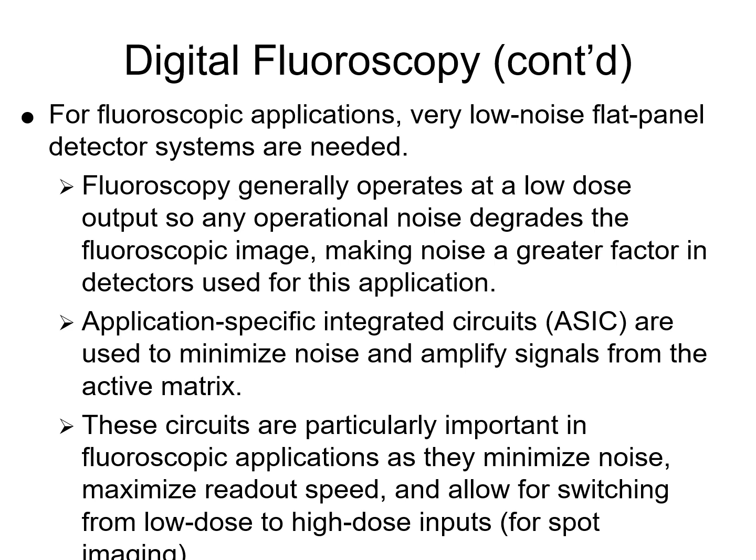Or sometimes they call those eddy currents. What's an eddy current? It's a current that flows in a circle, or it flows against the flow of the intended current. Okay? And so you'll have eddy currents. When eddy currents form, rather than the electrons transitioning down the circuit line in a linear fashion, the electron will just spin and loop back around, like on the wire or on the circuit channel or whatever it is. And so the electron won't really go anywhere if it gets caught in an eddy current.